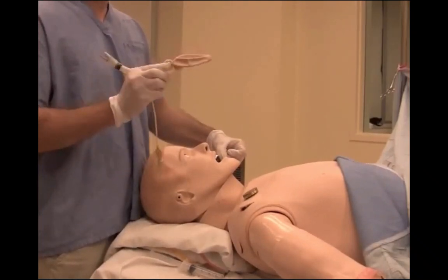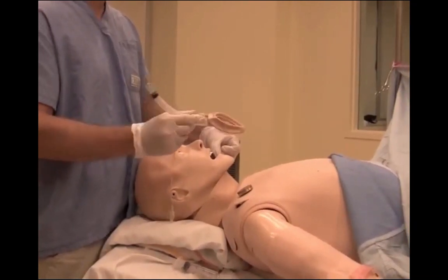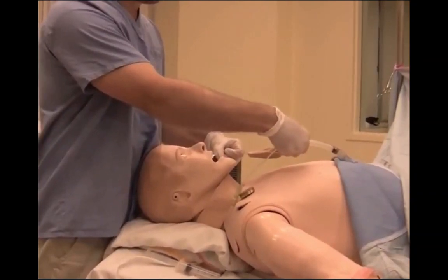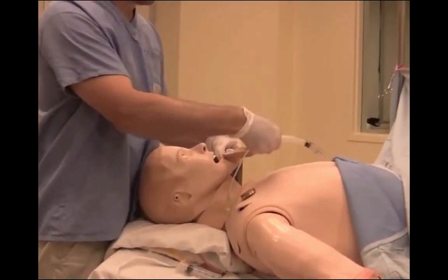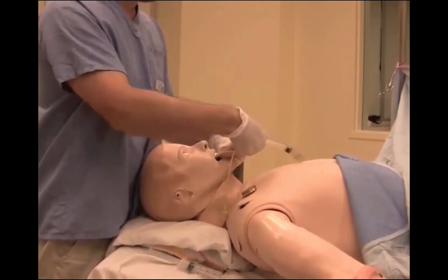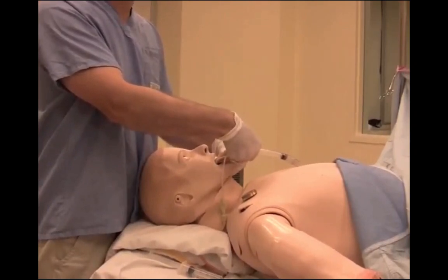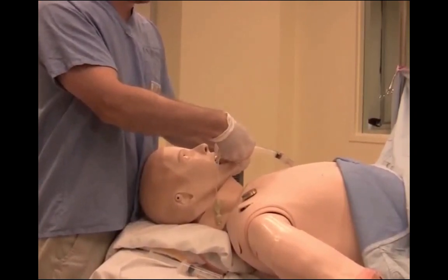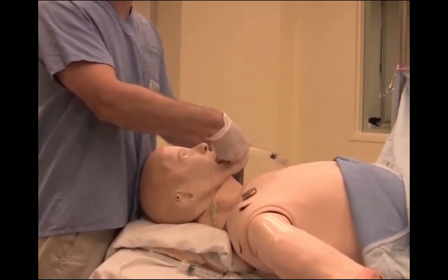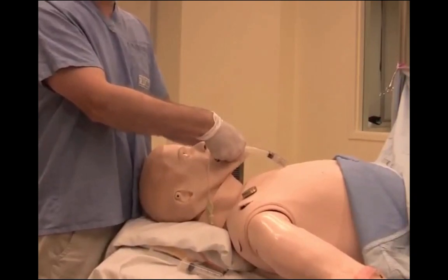Upon insertion, classically, it's been described as if you're holding a pencil, and you want to approach the mouth from the thorax at an approximately parallel angle. You introduce the tip, and the tip is to be pushed against the hard palate, and as the LMA is advanced, it should advance along the hard, then the soft palate. The purpose of this is to advance it around the tongue.